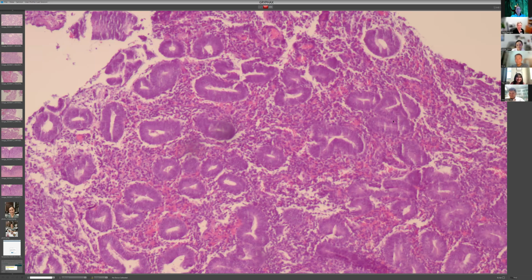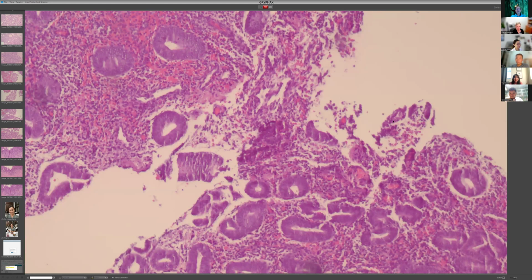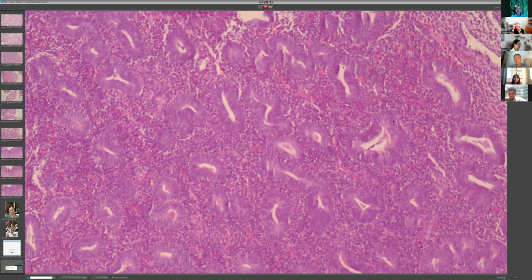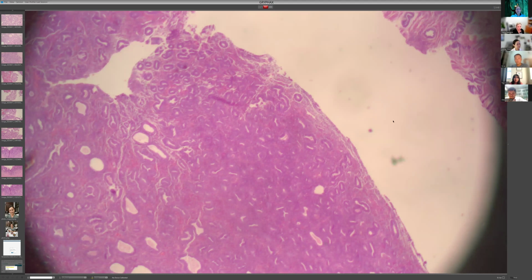An inexperienced observer looking at something could say, "Oh, this is not normal. This is crowded, or this is different than the background glands." That would be a much more reproducible criterion. And so I think what Esther's been trying to say here is you have to be able to quite simply see that it looks different, and therefore it's not going to be normal.